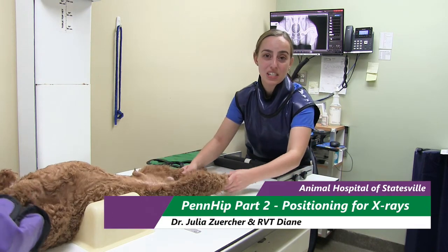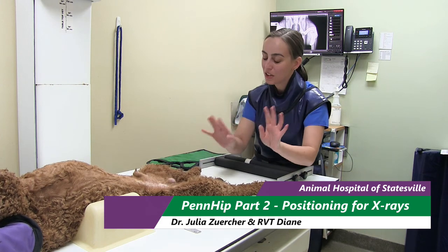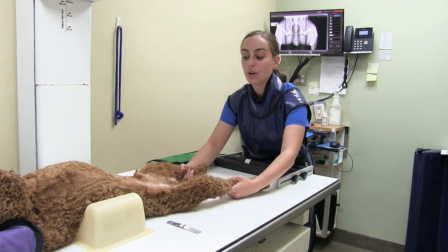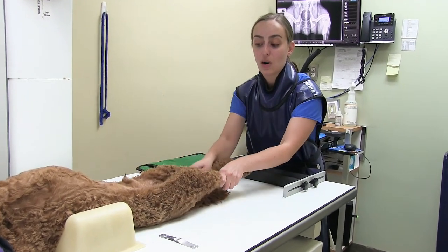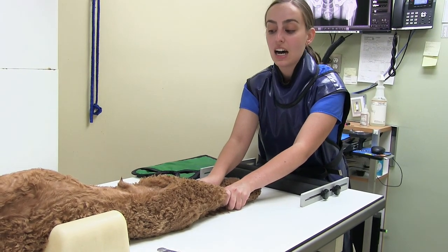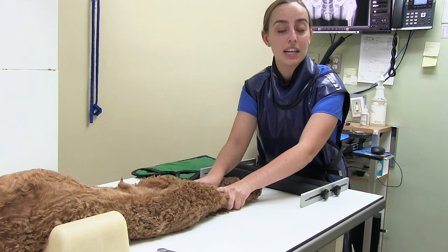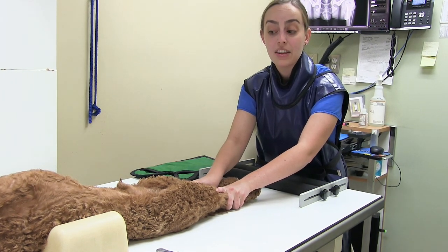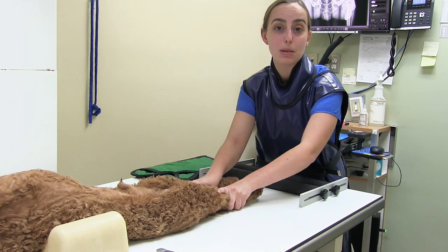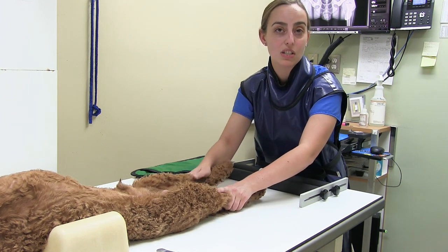The PennHIP procedure consists of three x-rays. The first view is the classic OFA shot, where we're looking at the pelvis when it's extended, any signs of arthritis in those hips, and what the hip conformation looks like. This is the same shot used for the OFA hip test, and some people do elect to submit both when they do a PennHIP so they can also have that OFA.